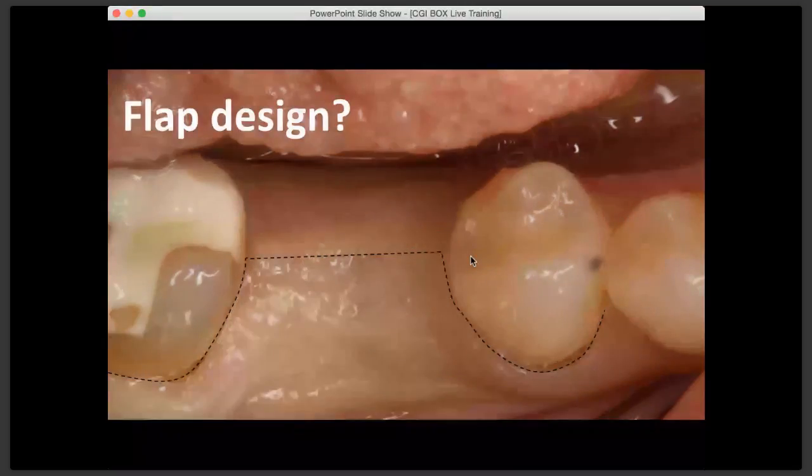If you want to complicate things and add a soft tissue graft and do other things, that's okay too. I'm not saying you can't do grafting here, but if you can utilize the tissue on top of the ridge to the patient's advantage and get some good attached keratinized tissue to the buccal of the healing abutment, it's free and simple to do. So remember, simplify, simplify, simplify. That's really the key to success. Don't overcomplicate things, okay?